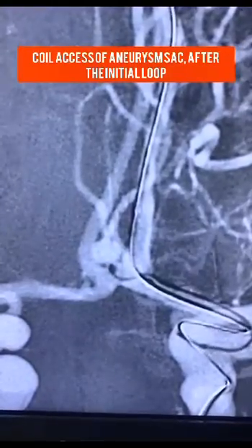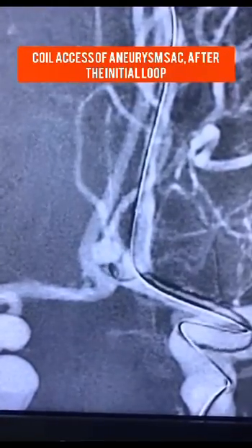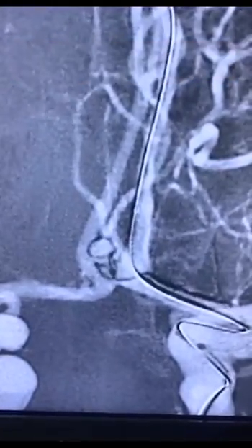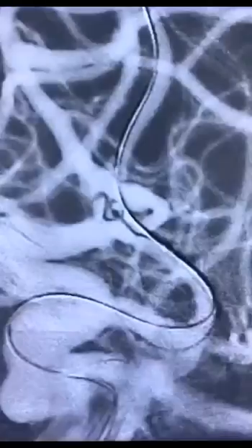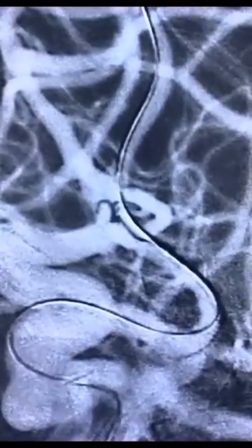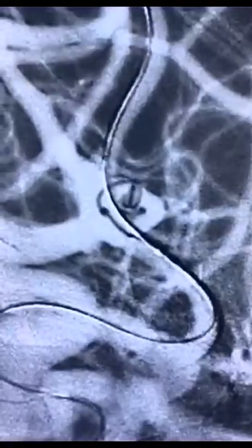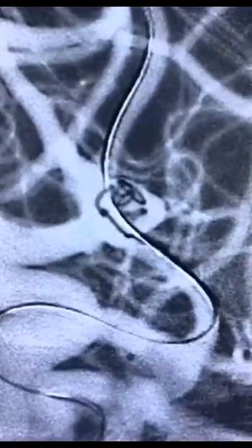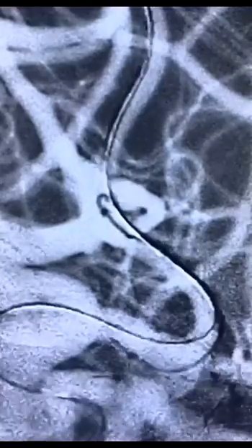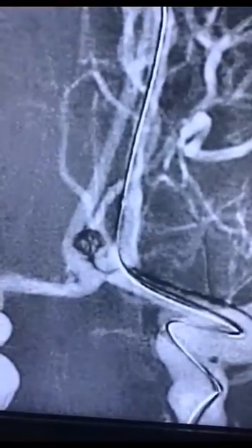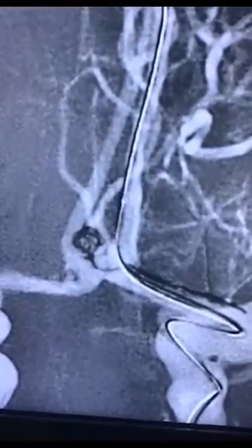Following that, the first coil was introduced. Although the first loop was outside the sac, further loops entered into the sac. The coil is then retrieved at such a time that the tip of the coil is within the sac, after which the coil is pushed further so that the rest of the loops are within the sac.